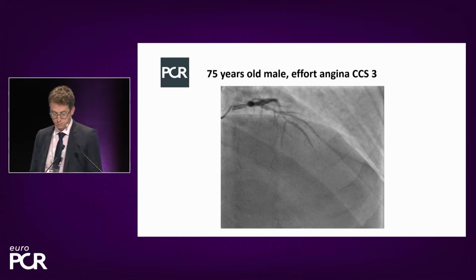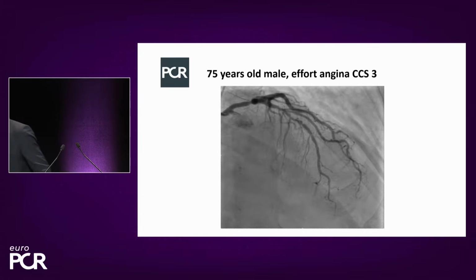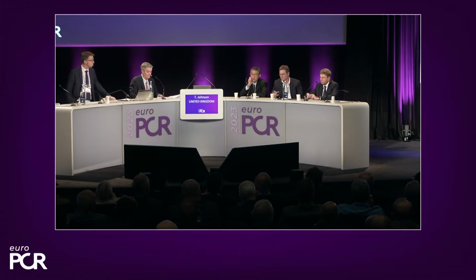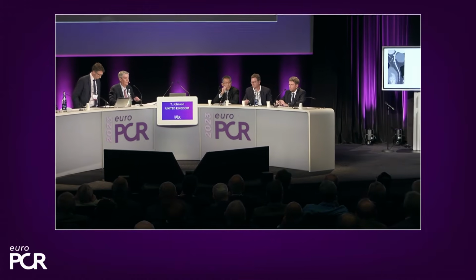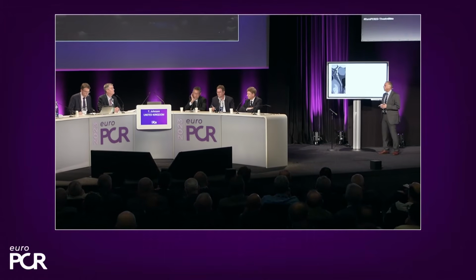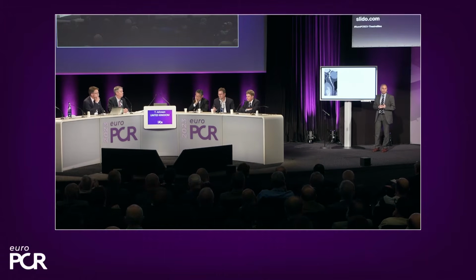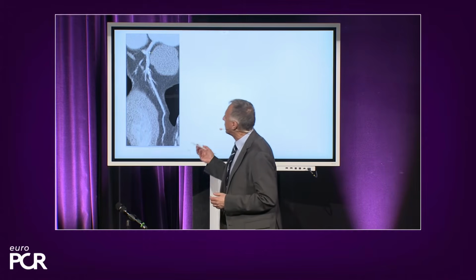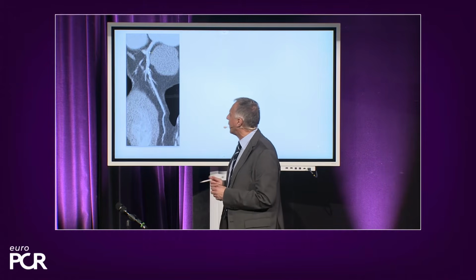So we have actually clearly a patient with coronary heart disease deserving treatment. And the workup included the CT scan that is becoming more and more part of our practice in those patients that are stable. And so I would like to start reviewing the CT scan.